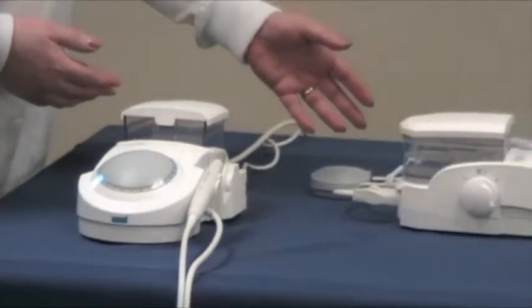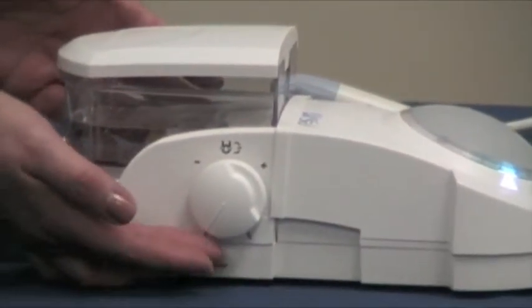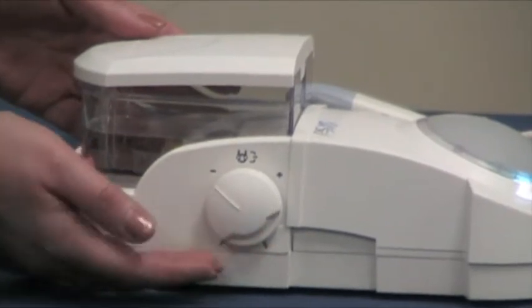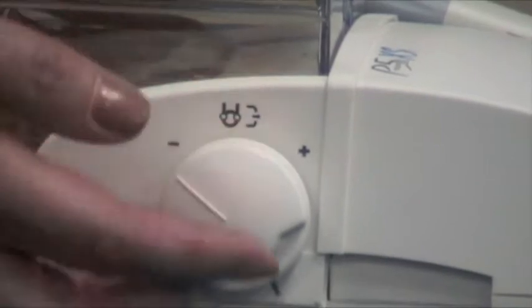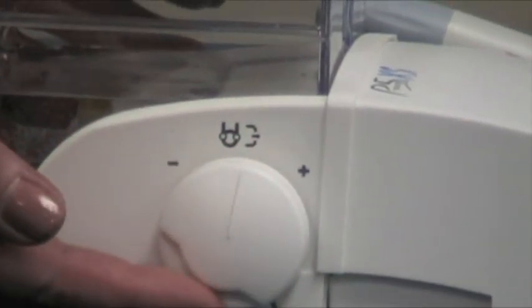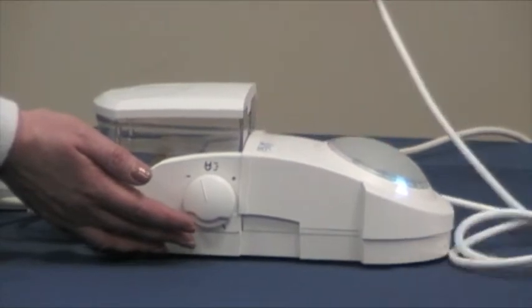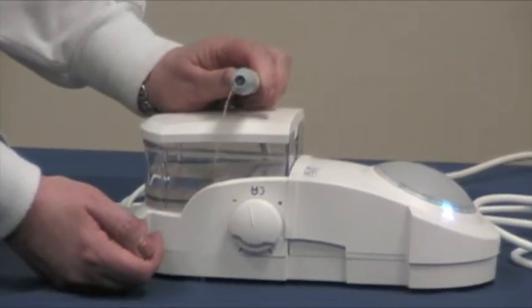Now we'll show you the same unit, but a side view of the irrigation knob. It's at the off position now. We gently move it clockwise — the minus sign is for less water, and the plus sign is for more. When you're through using it, you can use the convenient push-purge flow button. Just push it gently, and you can purge out your medicament in 15 seconds.